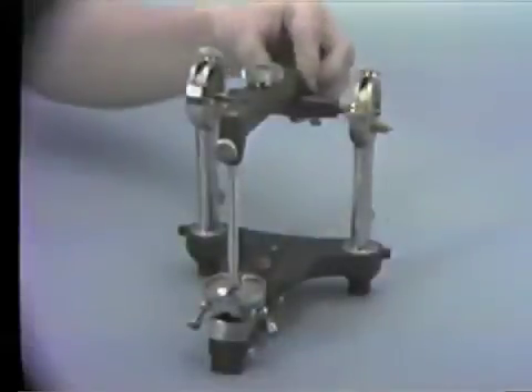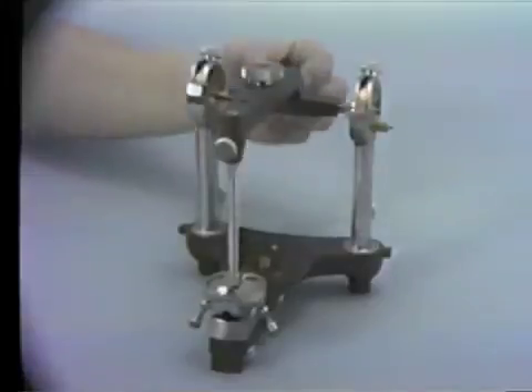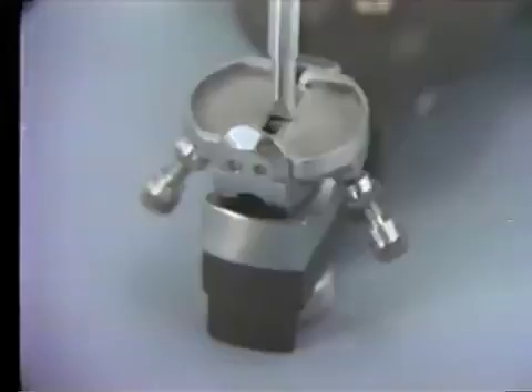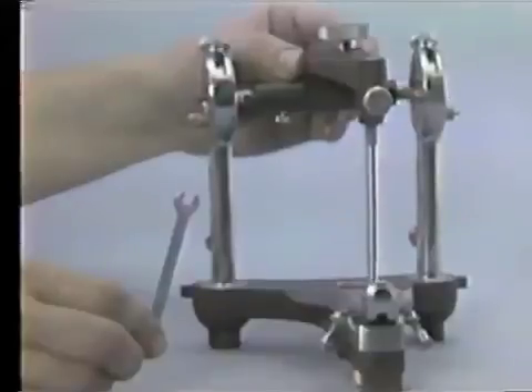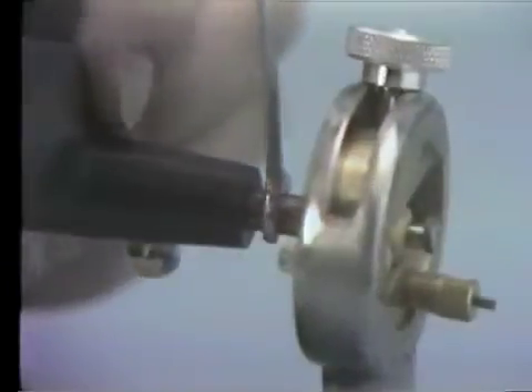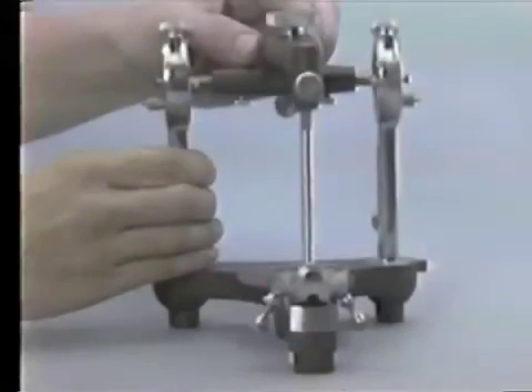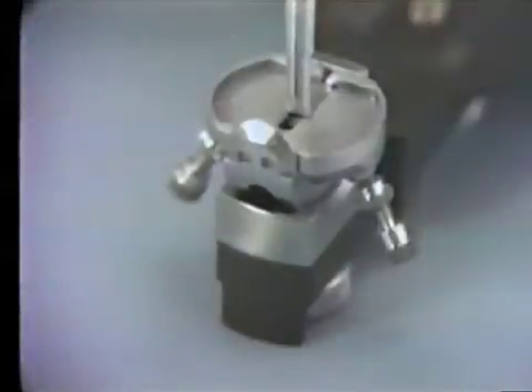Loosen the two locking thumb nuts for the condylar shafts found on the undersurface of the upper member. Check the play — the side-to-side movement of the upper member — and the lateral movements of the pin on the table. The play should be less than 0.1 millimeters but greater than zero, and the incisal pin blade should make complete contact between the inner edges of the lateral wings of the incisal guidance. To correct for excessive play or for incorrect lateral placement, the condylar shafts can be adjusted by rotation with a 7-32 inch wrench. With correct adjustment, the pin should be centered laterally on the table.